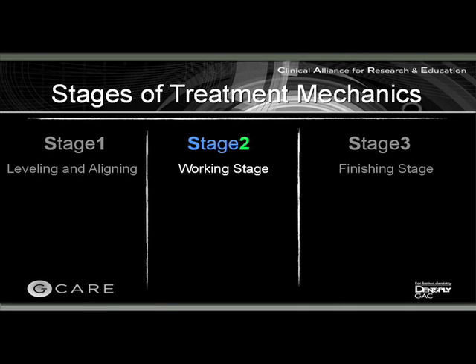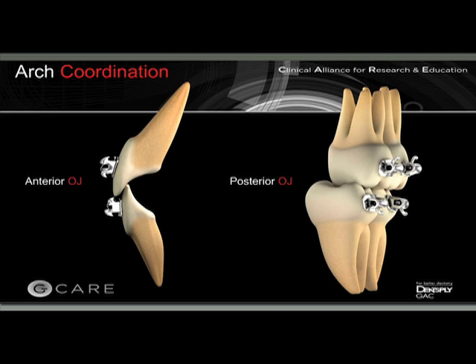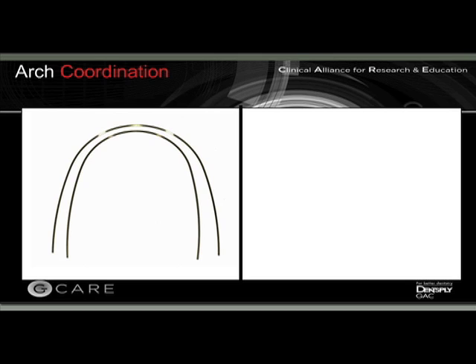So stage 2, working stage. I would like to emphasize here a couple of things. One is arch coordination. Arch coordination is very important, and that refers to overjet. We have an anterior overjet and we have a posterior overjet, and you see here the arch coordination means we need to achieve a proper overjet from second molar to second molar. As you can see, the upper brackets and tubes are far more buccal than the lowers. That's about 2 to 3 millimeters, and therefore we need to coordinate the wires. It's very important, every single stainless steel arch wire has to be coordinated.